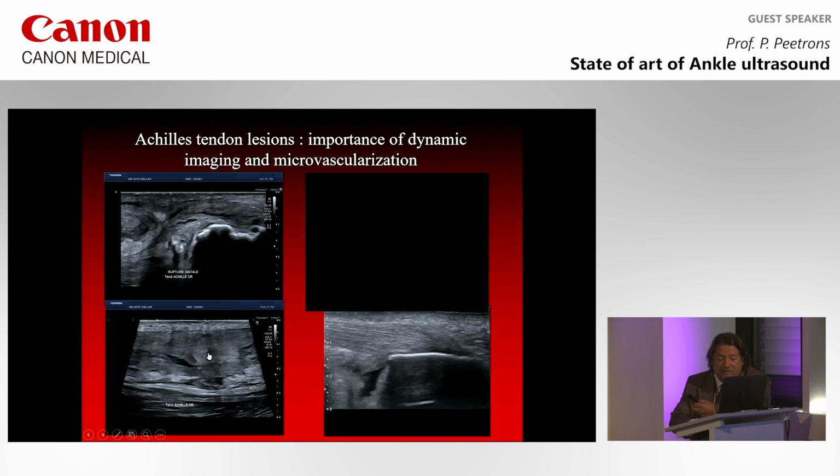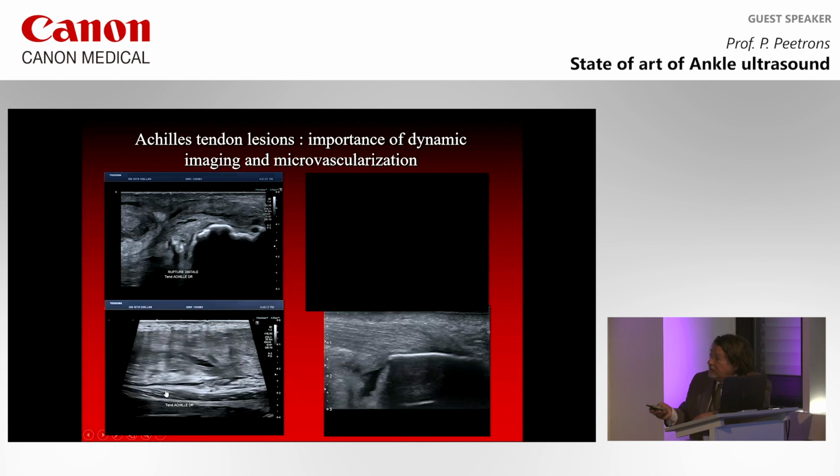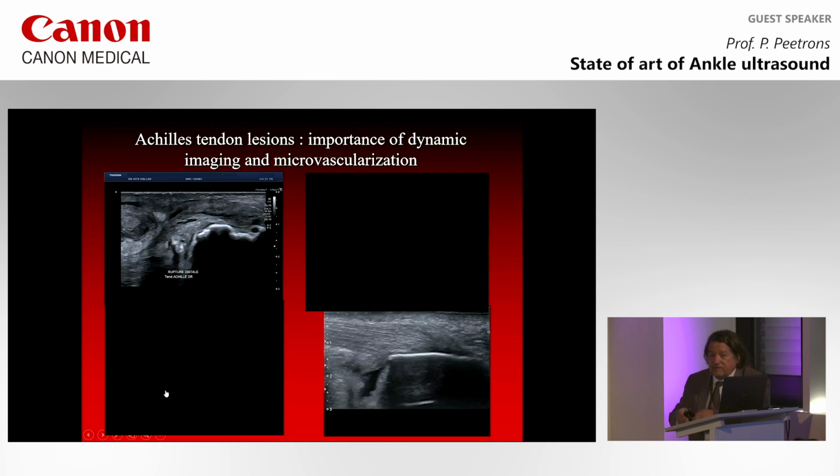What happens with this? Is it exactly the same as this? Let's have a look. When I move the ankle, everything is moving. The proximal part of the tendon is moving. The distal part of the tendon is moving. So this tendon, which has been seen 6 weeks after the injury, is already in the phase of healing. You must not send this tendon to the surgeon. It will heal a little bit slower, but it will heal without any problem.